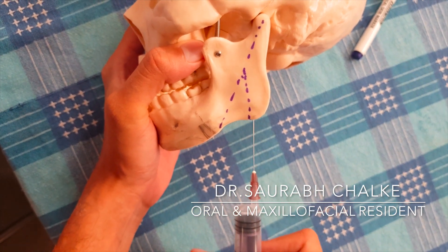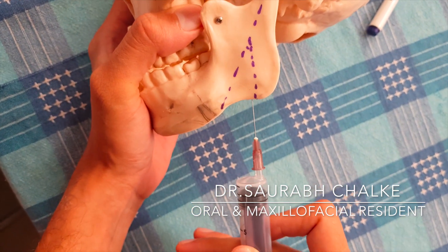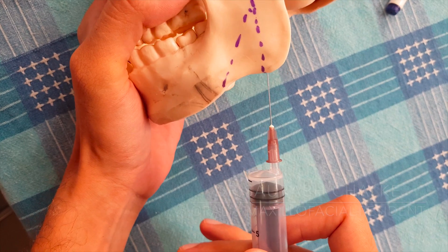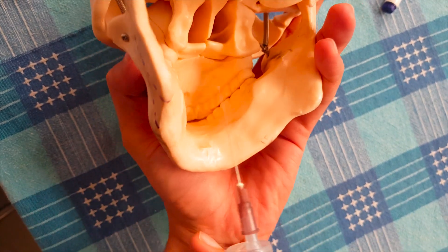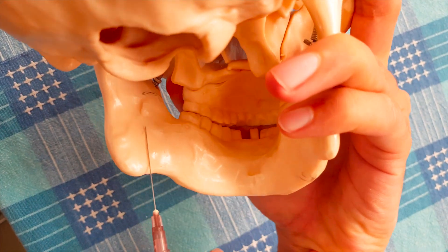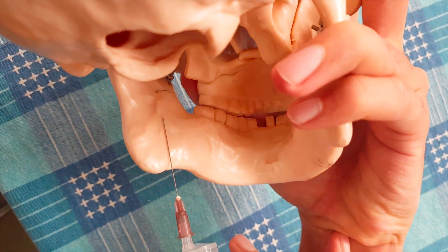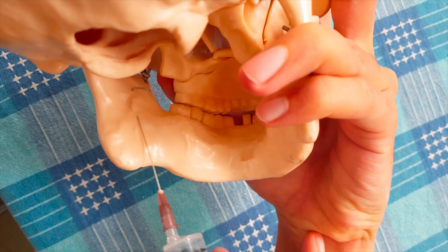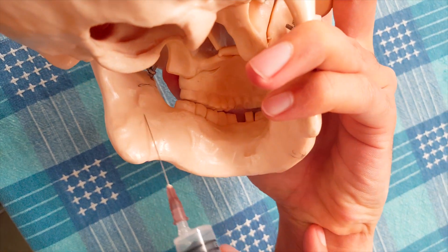When we enter along this line extra-orally, we will end up reaching somewhere near the pterygomandibular space, where we will deposit our solution.